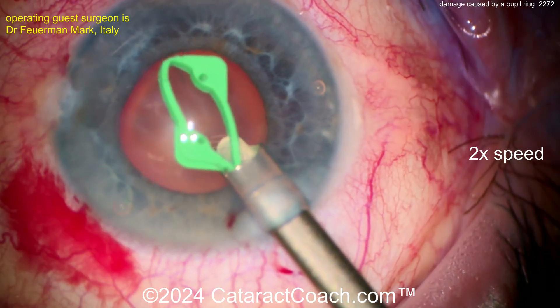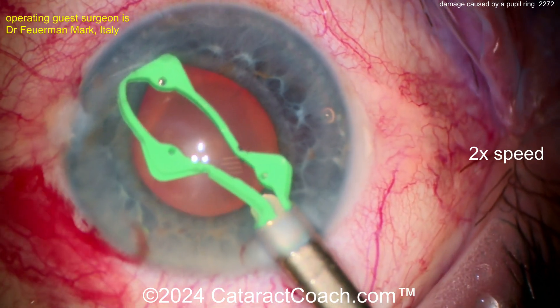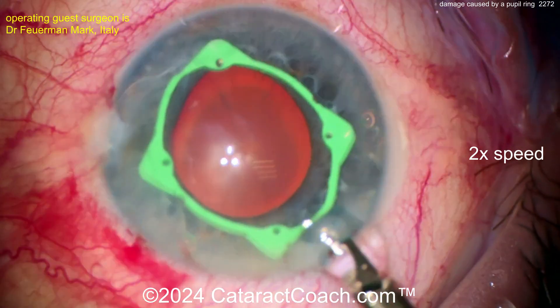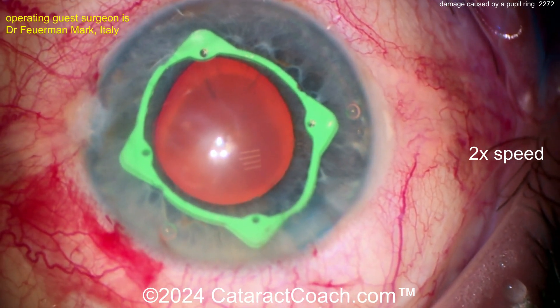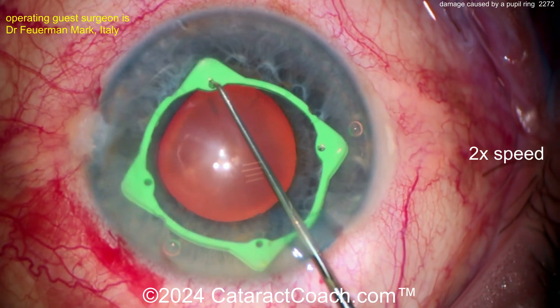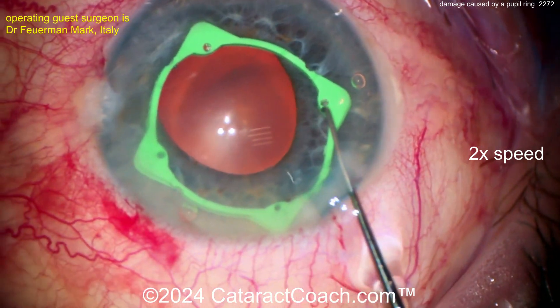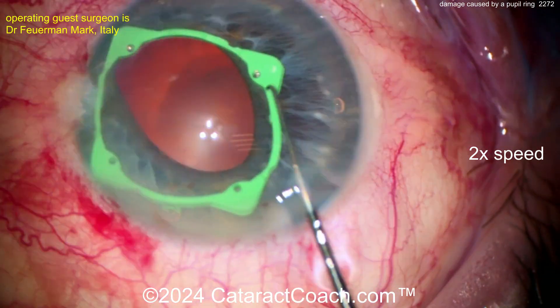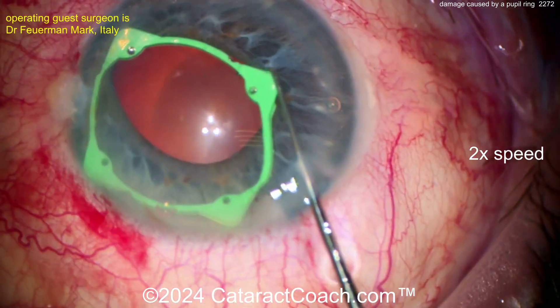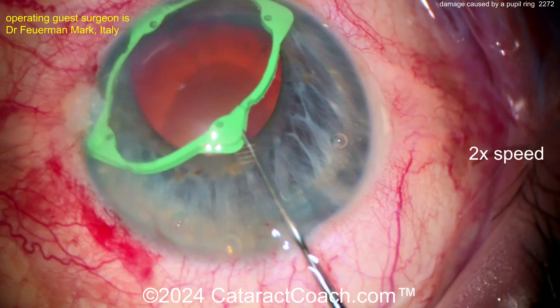You can see this is injected into the eye nice and slowly. As it goes in, we're going to hook these four segments onto the pupil margin, and that's going to give you the expansion. Now using a Sinsky hook, each of these segments has a little eyelet — that's helpful. Now be careful: the patient has this blue iris, and as we know, the blue iris is a little bit more fragile than a beefy brown iris.